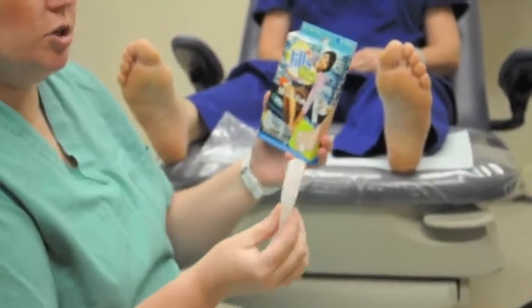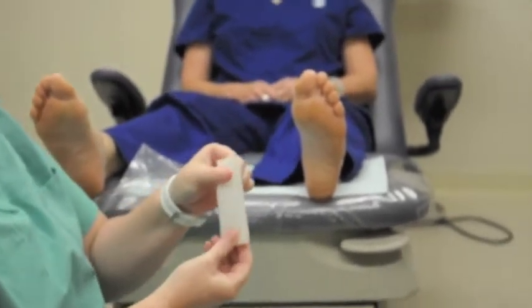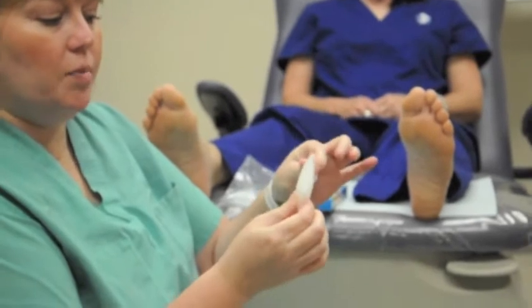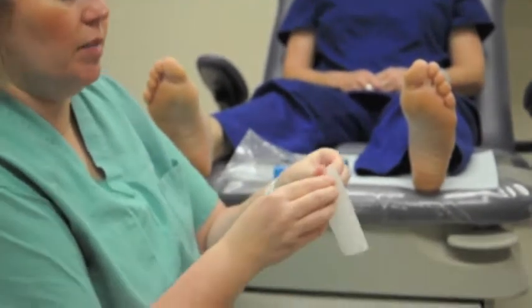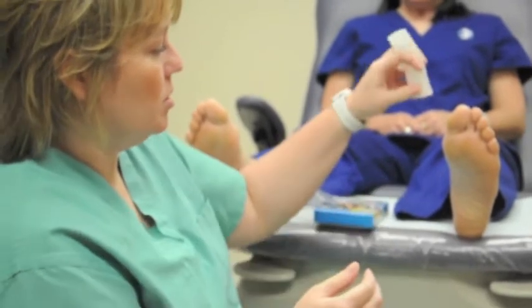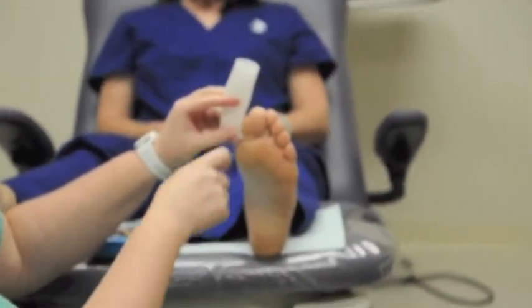This is an all gel toe tube. Dr. Jills makes this one. All it is is a big silicone tube. It comes in different sizes for big toe and little toes. Basically all you do is size this little fella on the toe so that it is about the same size as the toe.